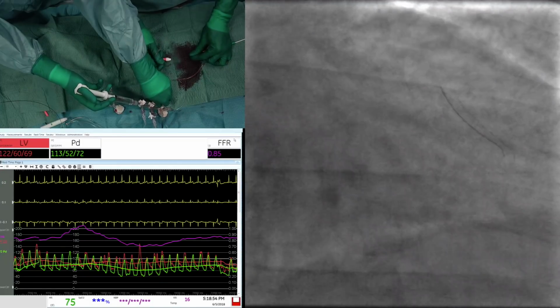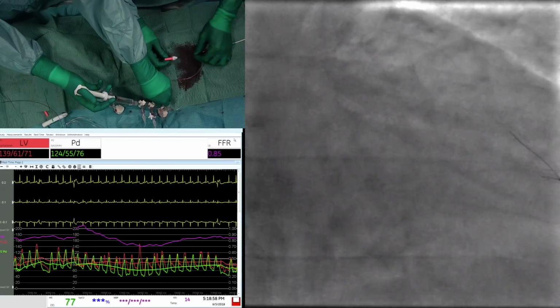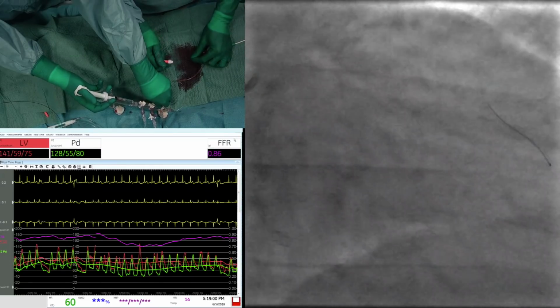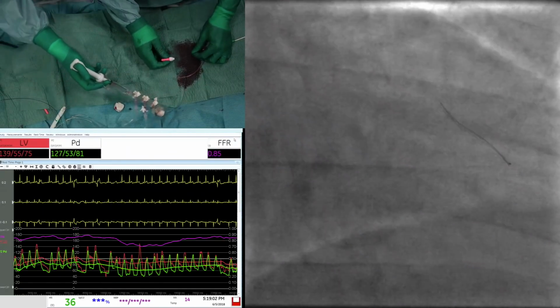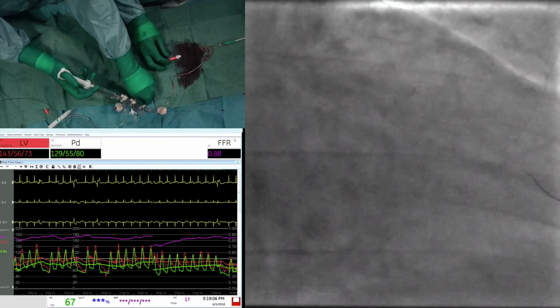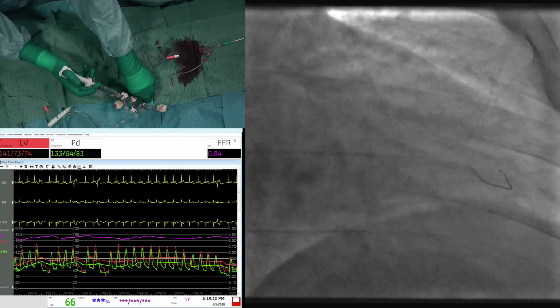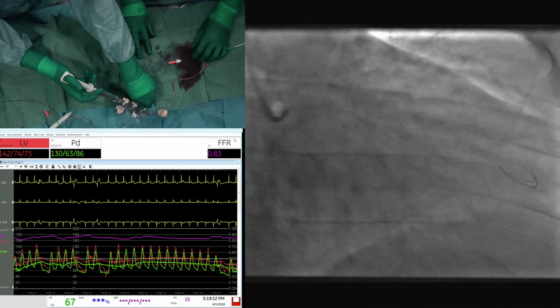And all these nitty-gritties are extremely important for pressure measurements. And this is, of course, completely independent of the type of pressure wire. Okay, let's have a look to where we are. I will decrease the magnification even twice. Give us a good shot.